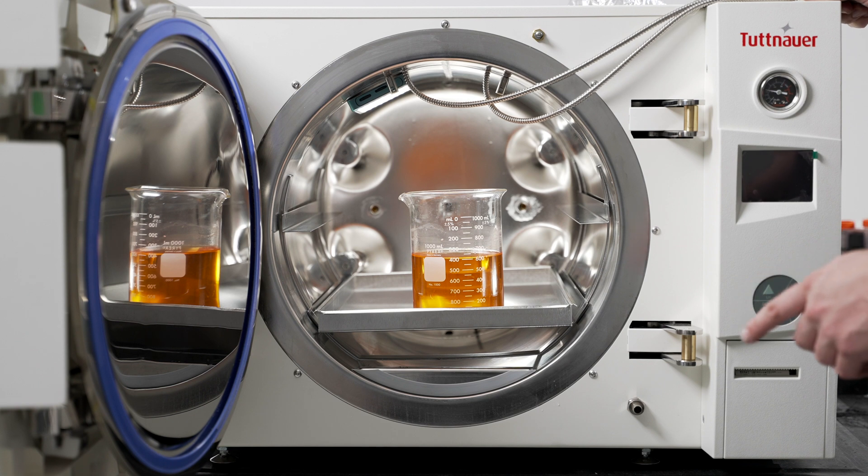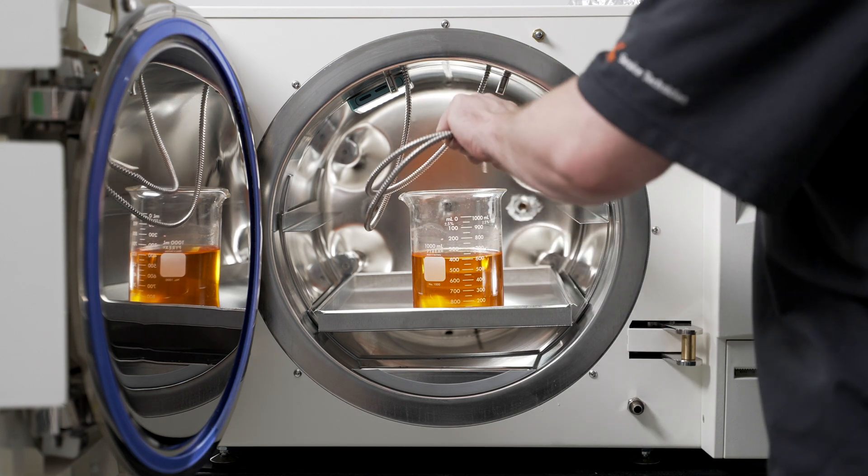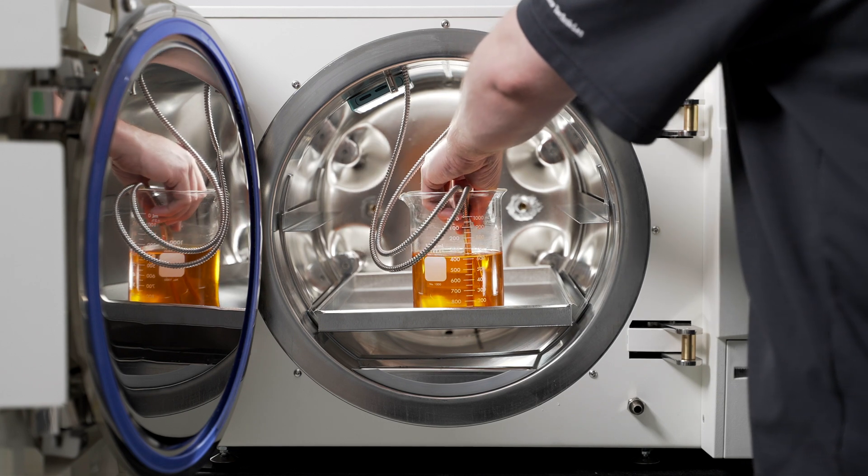When sterilizing liquid media, be sure to remove the probes from their holders and place them both into the same container. This ensures the most accurate temperature reading.